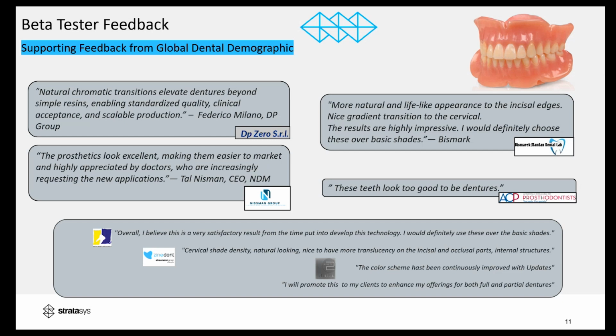Regarding three shape support for the DME, it's something that we're working on. It's not going to be available for the launch. We're working on optimizing the best way to do it with three shape. At the moment, the base shade gingiva shades are going to be kept in the 3MF file if you assign them in three shape and use the 3MF workflow. You would need to reassign the tooth shades with TrueVoxel after the analysis.